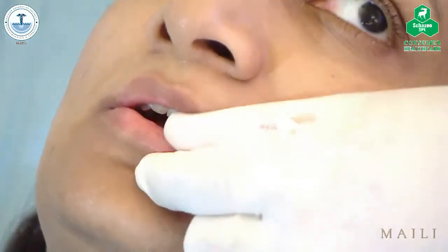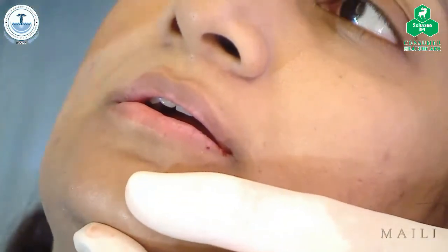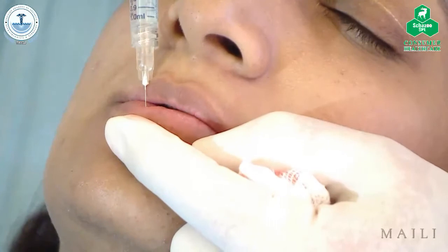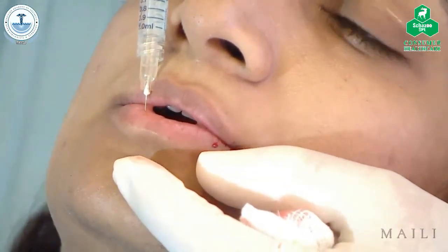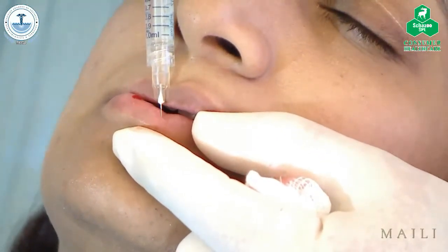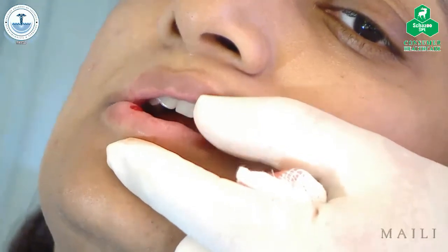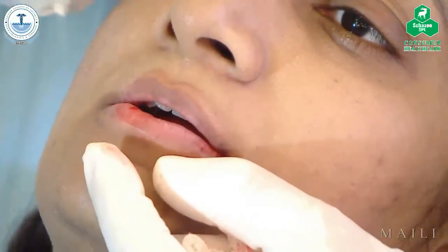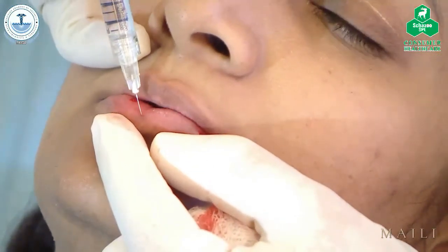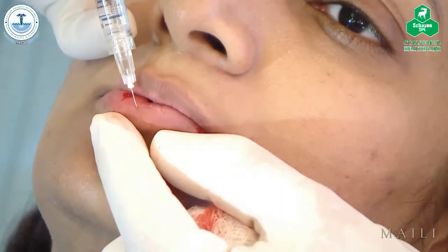To get those tubercles, you can come from there, you can come from out. It's up to you. So, we'd like to see your technique. Well, I just do this. Excellent. Point 1? A bit less than that. And now I need to do a little bit in the middle to invert it. And instead of going there, I just go a bit more close to the edge. And a bit more superficial, not so deep in the muscle. That's it. That's it.